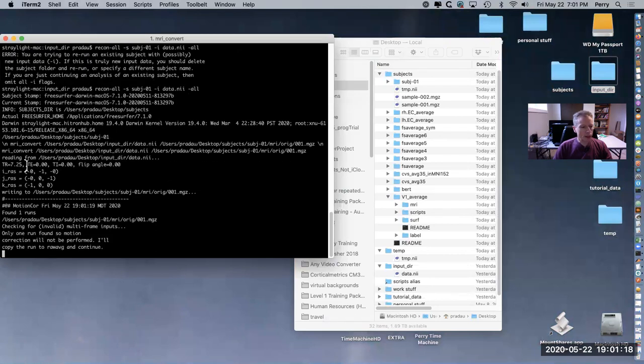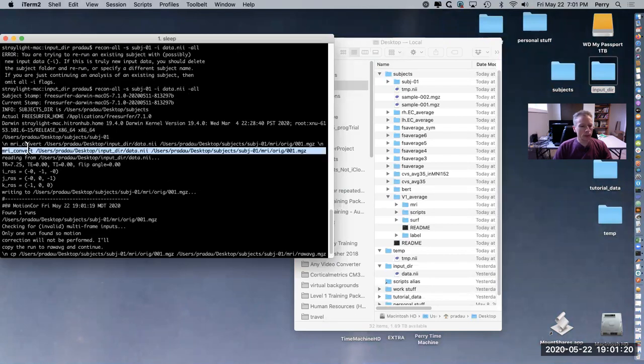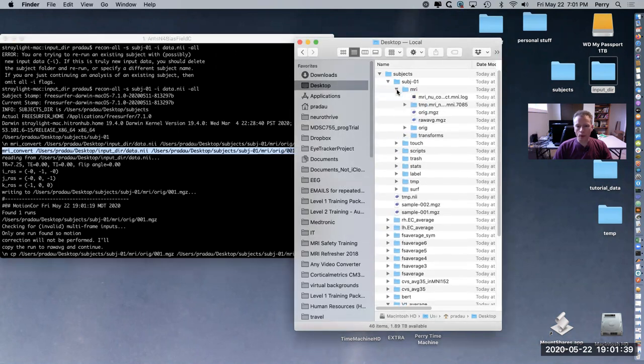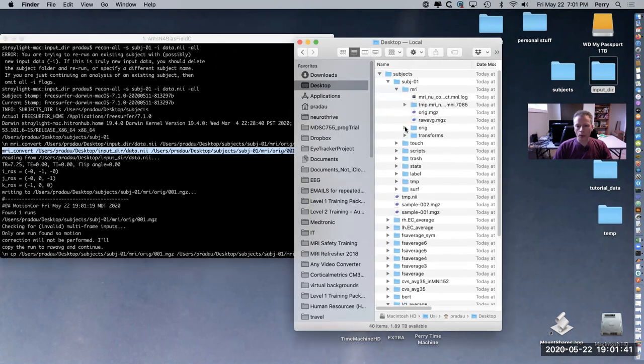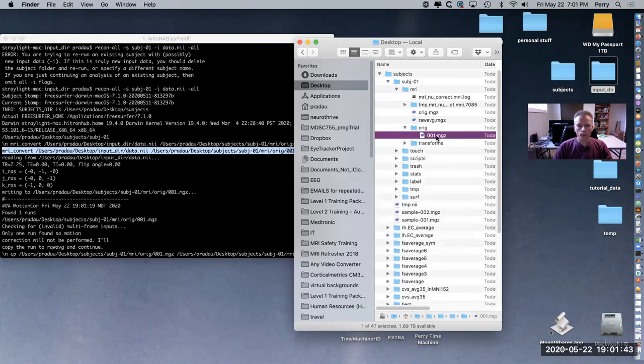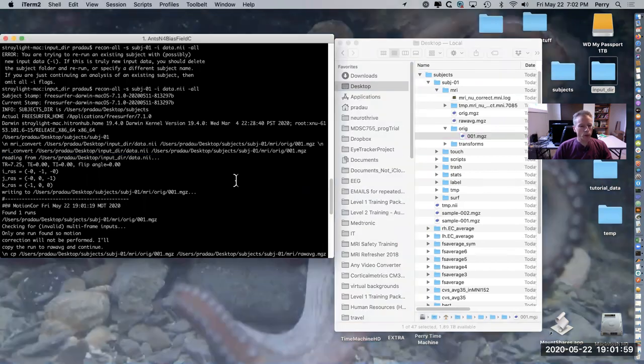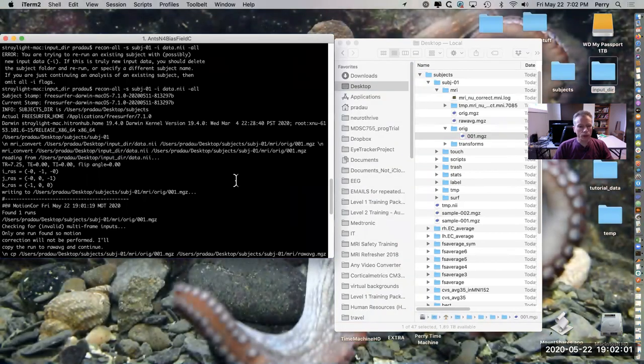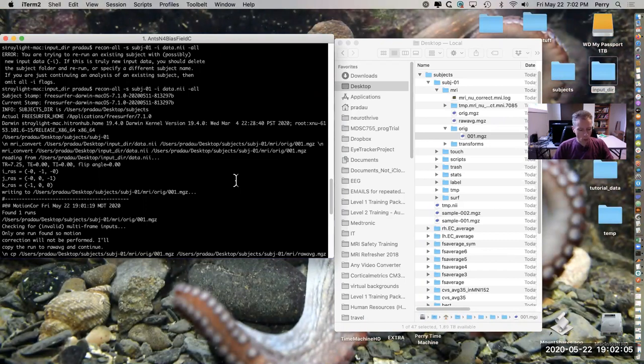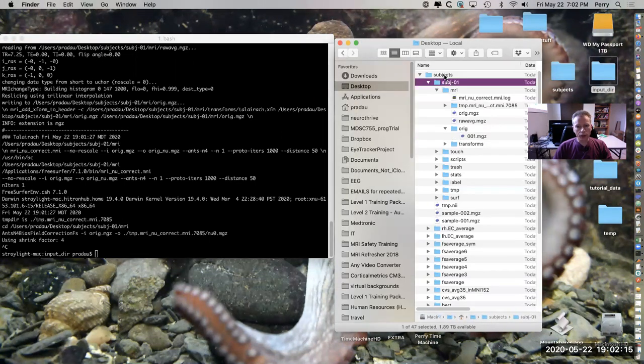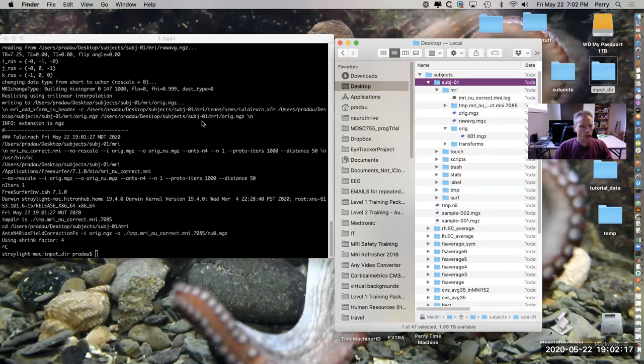You see in this line here it's actually converting from the initial file into the mgz file. This ridge is the one that's being created - this is the original version in the mgz format. Then after that it starts doing more steps in order to be able to extract the surfaces. I want to point out that you do run into this issue where the dash i is not required after the first time you've run and created this directory in your subjects directory.